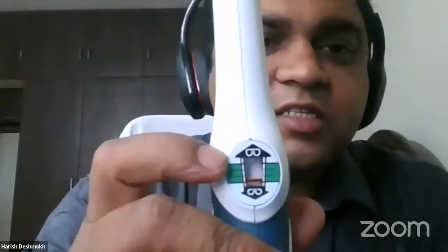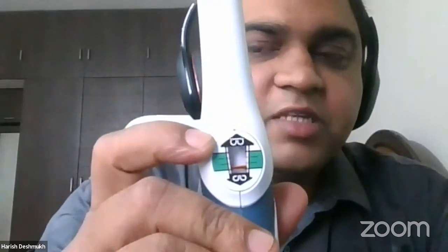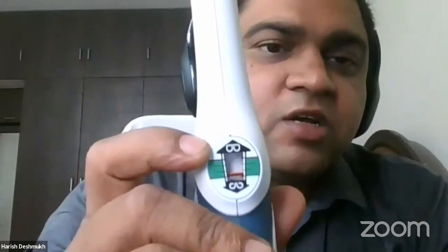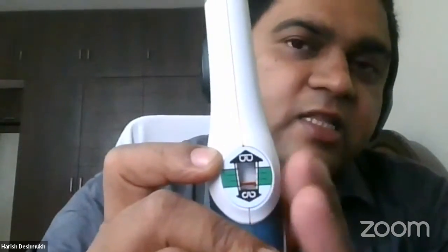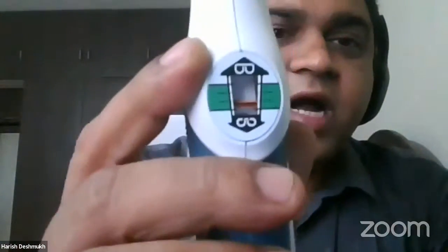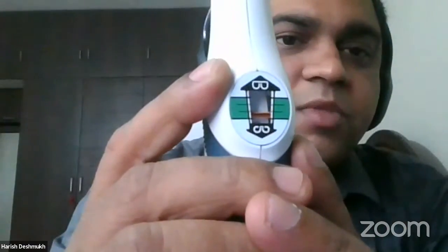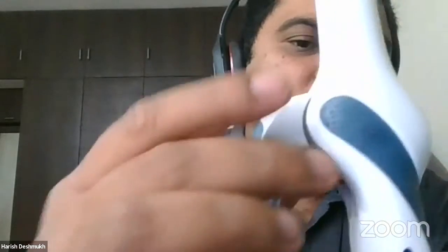Then we have a tissue compression scale, which is available here. You can see here. The tissue compression scale gives you a range of stapling height, basically 1 to 2.2, so that whatever the tissue thickness is, you can accommodate the tissue easily in this stapler. Once you are closing, you'll have a feel of hand tightening. It may be anywhere within this green range on the tissue compression scale. Once it has reached, you have a safety lock.